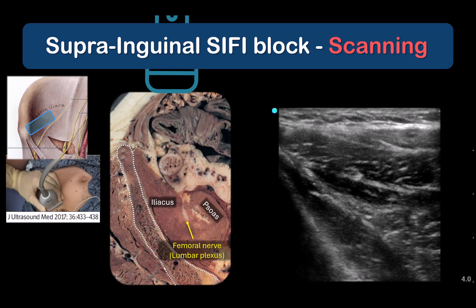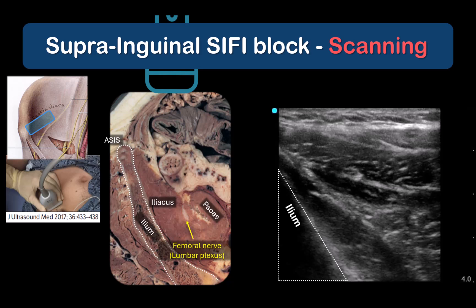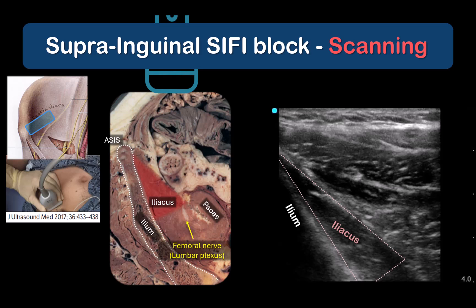Identify the key sonographic landmarks. First, the bony ilium, recognizable by the dropout shadow. Second, the triangular cross-section of the iliacus muscle lying on the ilium, encased in the hyperechoic fascia iliaca.